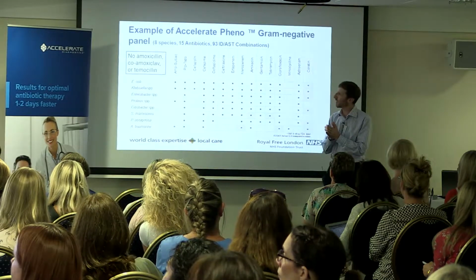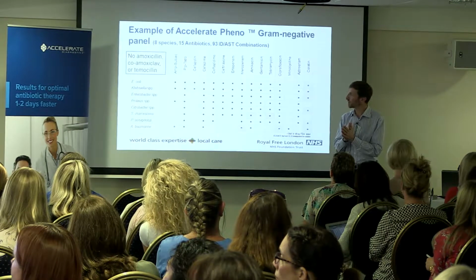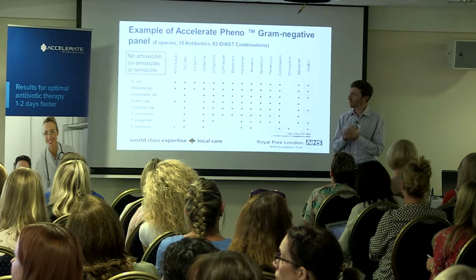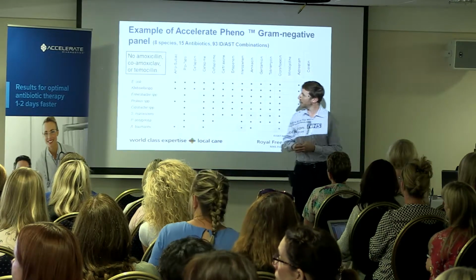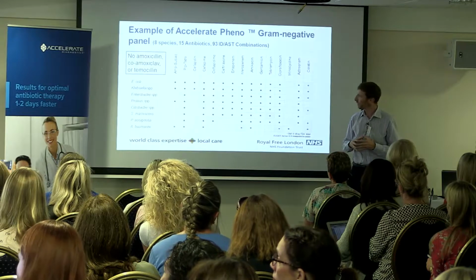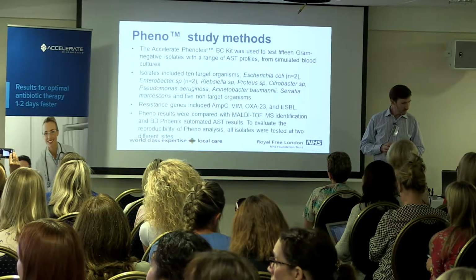Similarly, co-amoxiclav and temocillin we use a lot of, particularly in our renal population. So having these on the panel would really help us narrowing down and optimizing antibiotic therapy. And the gram-negative targets, you can see there's more than just E. coli, Klebsiella, there's Enterobacter, Proteus, so you get more information about the organism name and then the antibiotic sensitivities.